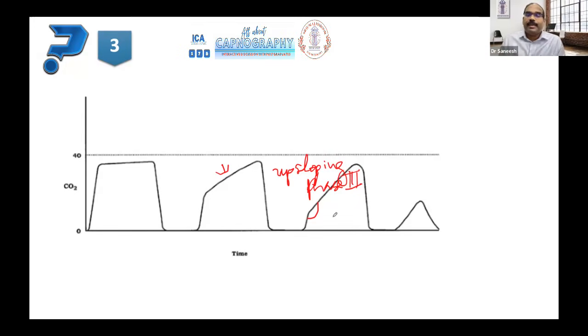That's it. Okay, if it is a bronchospasm per se, either troubleshoot the bronchospasm reason. First, the lighter plane of anesthesia. So increase the depth of anesthesia, maybe increase your volatile agent or give an additional dose of propofol or increase your dexmed or an additional dose of opioid or whatever. And then try to go for the bronchodilators. Of course, steroids are always in consideration.